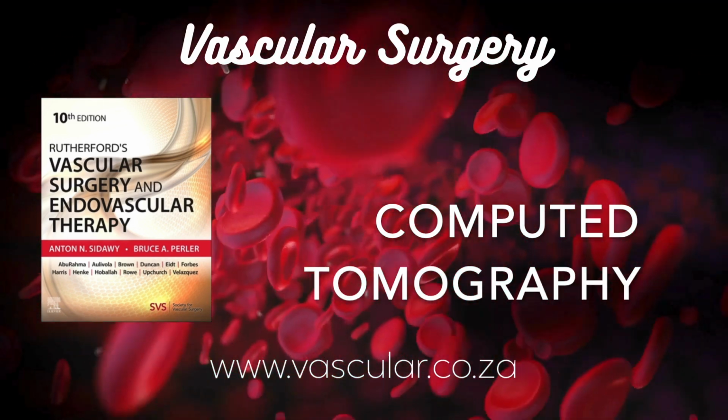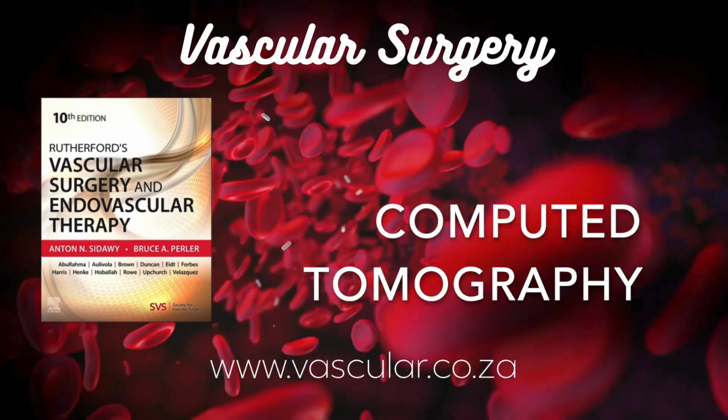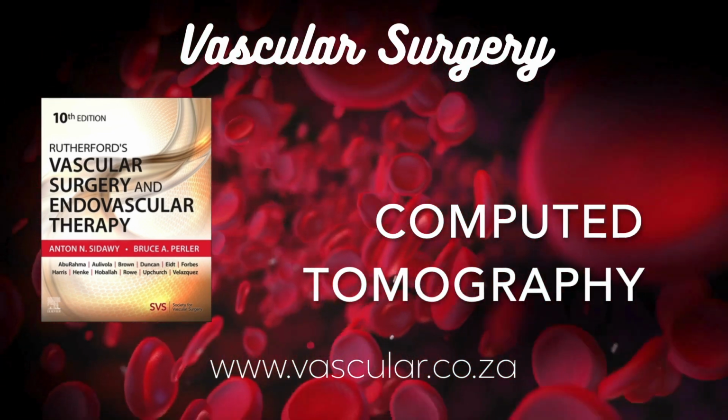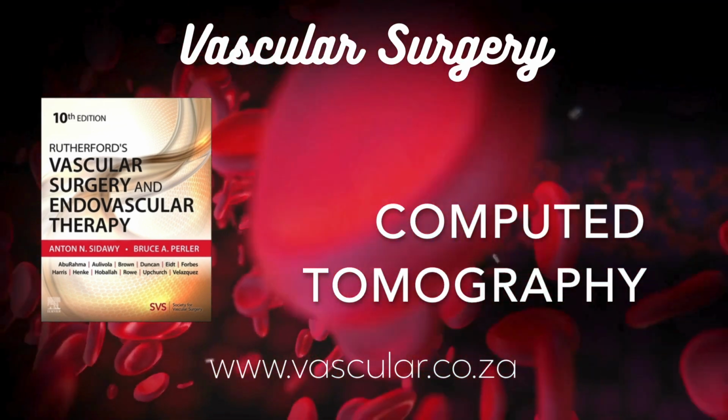And again, fewer images, less data to store and manage. The thinnest possible slice is always limited by the original beam collimation used during acquisition, though. Gotcha. And field of view, FOV, we touched on that for resolution. Can you adjust it after?